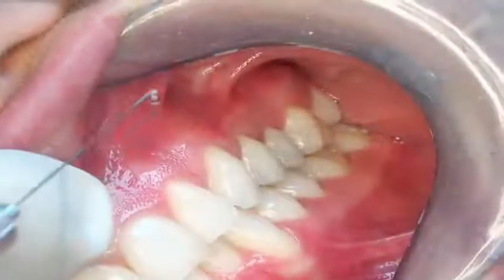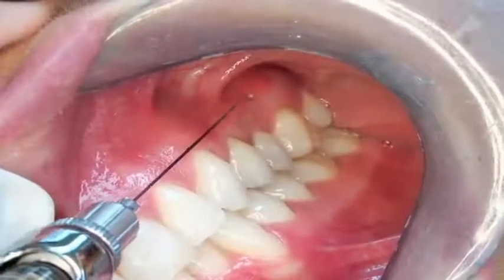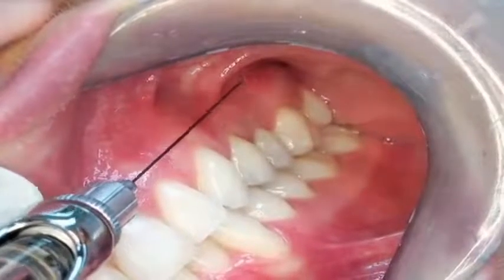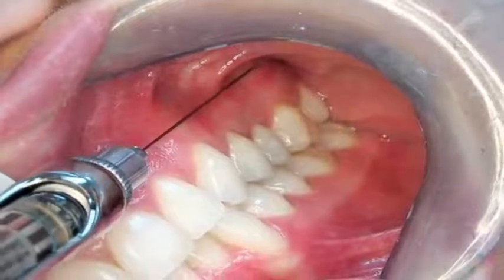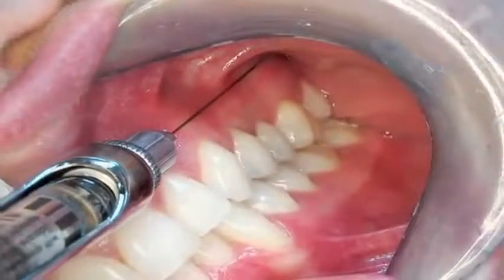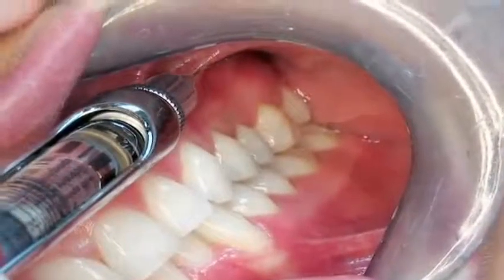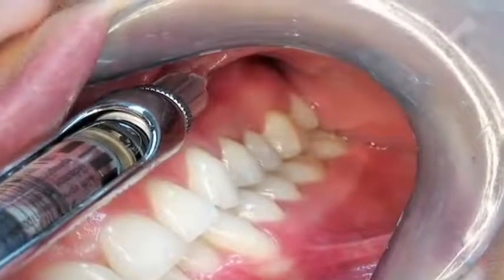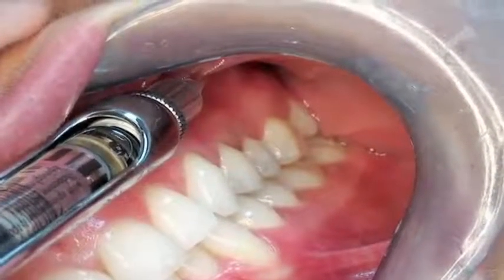In a patient, it is again about the level of the mucogingival junction and parallel with the occlusal plane. The needle is inserted at this level and posteriorly to about three-quarters of its length. The anesthetic is then slowly injected.